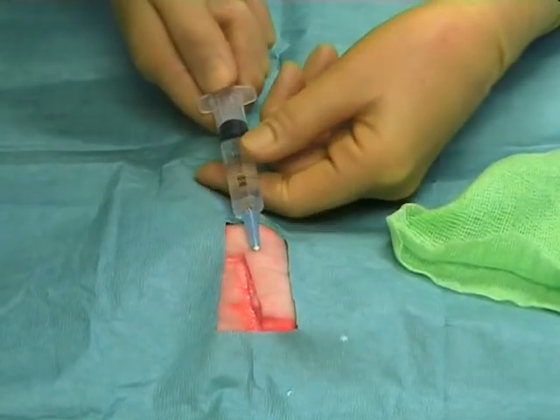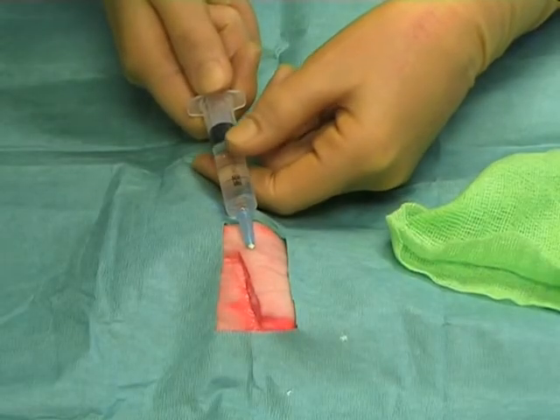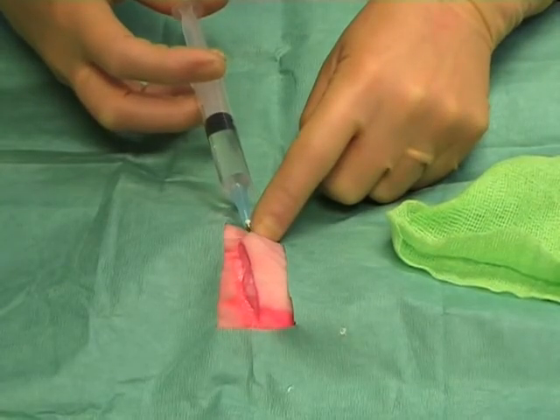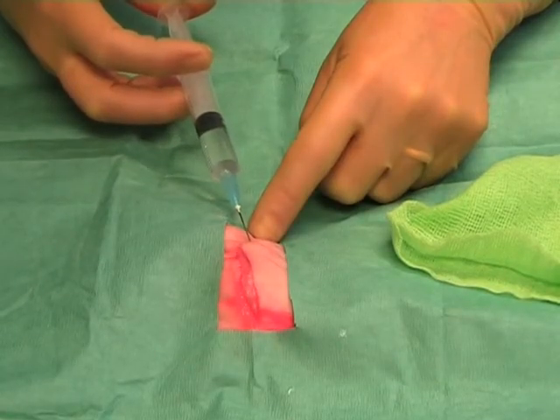draw back on the barrel of the syringe to make sure that the needle is not sitting in a vessel, and then slowly inject the local anaesthetic as you withdraw the needle. You should see the skin start to raise and become pale.